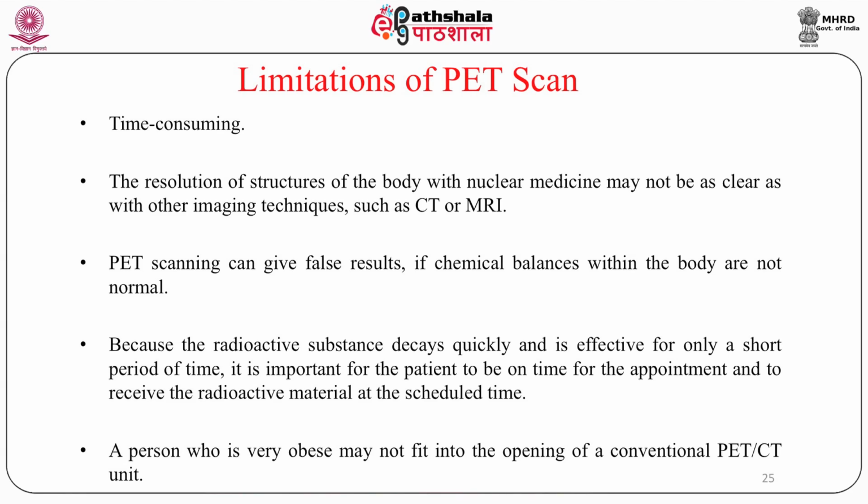In case of MRI or CT scan, the patient can go at any time and get the scan done, but that may not be possible in case of nuclear medicine examination, and apart from that, PET CT, because the fluorine-18 which is required has a short half-life. If the fluorine-18 is not there in the department, the scan cannot be done. So, if the fluorine-18 is already labeled with a compound and the patient is not there, he is going to miss it. So, these are the limitations of the PET scan.